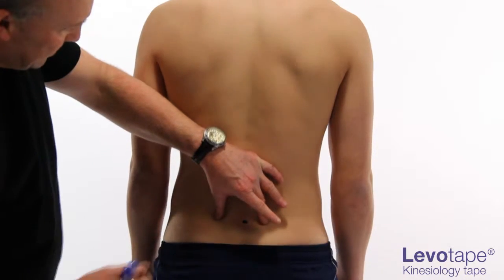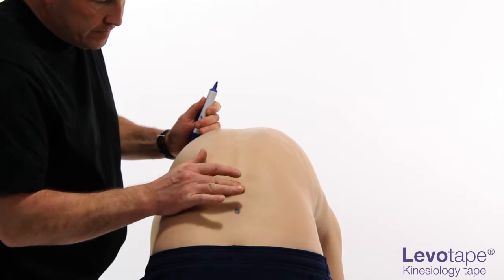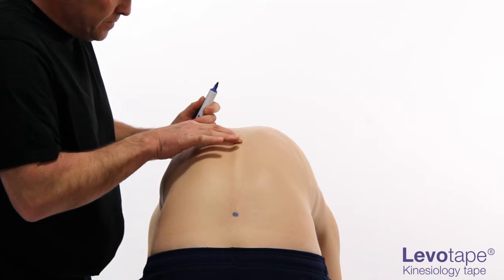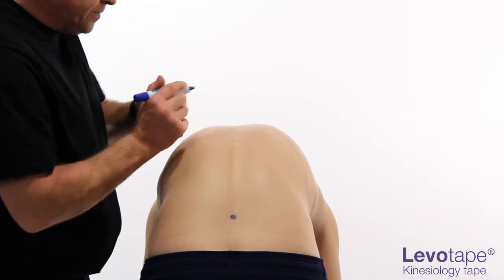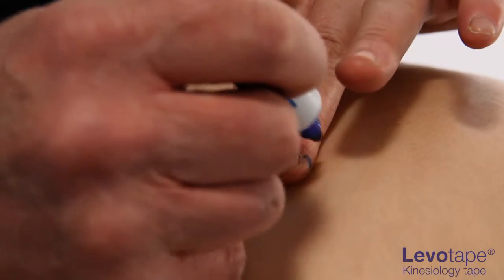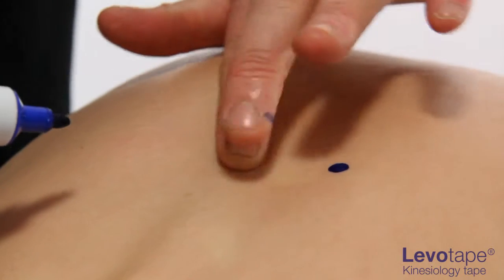Reposition the patient into maximal achievable flexion. Count up to the twelfth thoracic vertebra. From here, measure two fingers' breadths laterally on either side and mark these as the two endpoints.